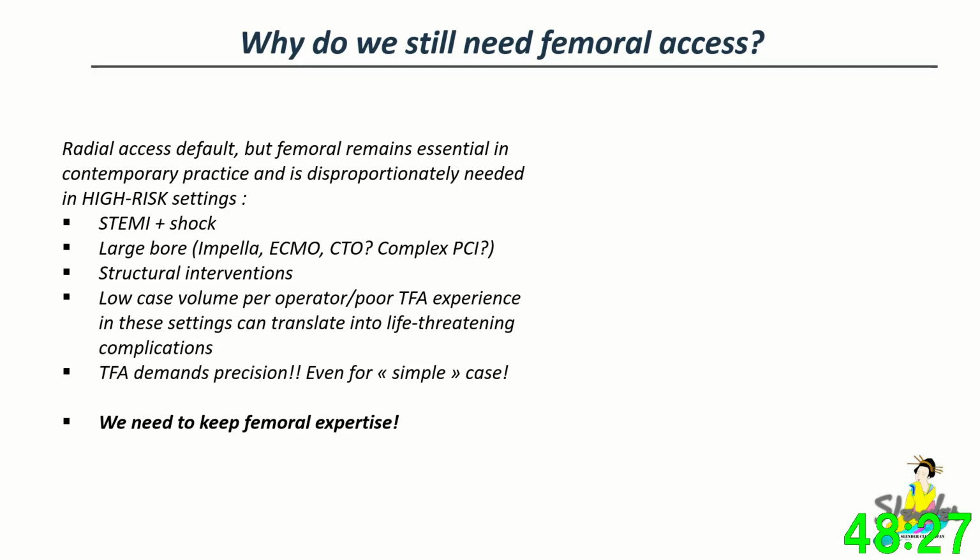Of course, radial access is the default approach, but the femoral remains essential in contemporary practice, and conversely is disproportionately needed in mostly high-risk settings, like STEMI and shock, for example, when you have to go for large bore, when you have to use mechanical cardiac support, or sometimes if you're not really a slender operator for CTO or complex PCI, of course, for structural interventions. And this results at the end in a low case volume per operator and relatively poor transfemoral experience over the year. And in these complex settings, it can translate into life-threatening complications.